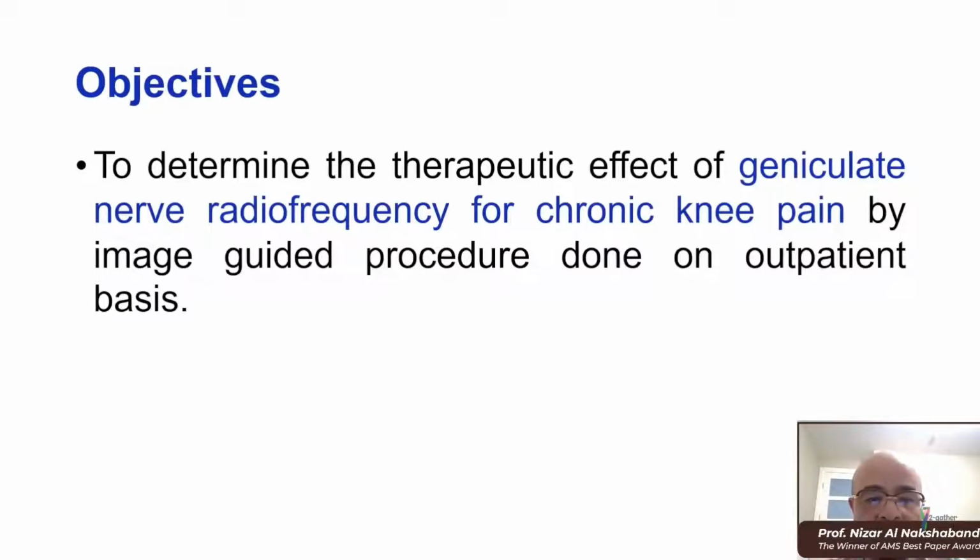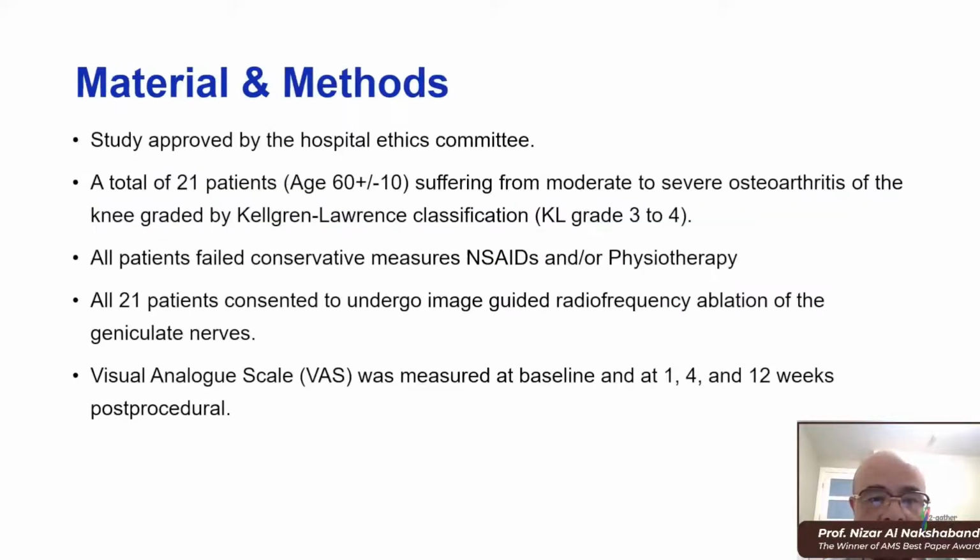The objective of this talk is to determine the therapeutic effect of geniculate nerve radiofrequency for chronic knee pain, by an image-guided procedure done on an outpatient basis by the interventional musculoskeletal radiologist.